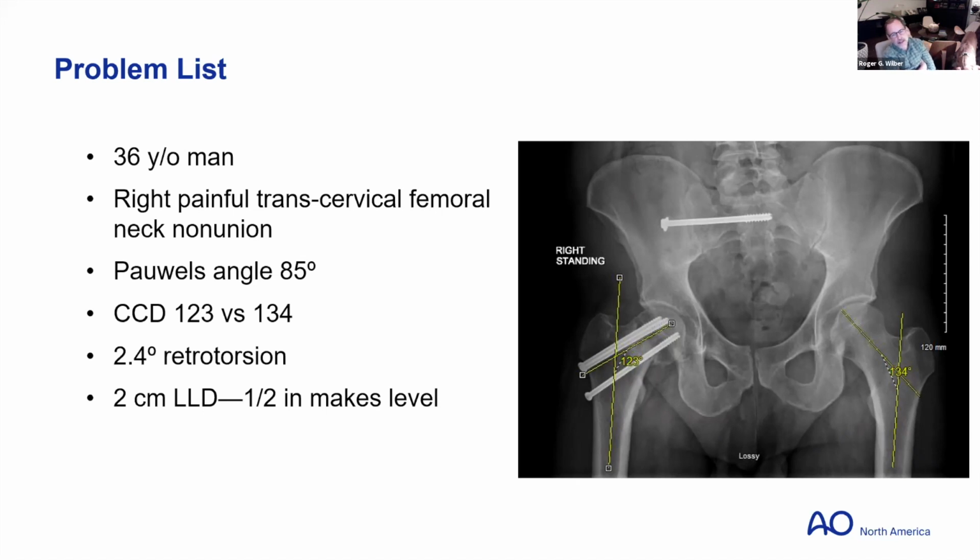My goal here would be to try to get the tip of the trochanter in the relative right position compared to the center of the femoral head. So where the tip of the trochanter is either at the point of the center of the femoral head, or I would probably try to go a little bit lower. The other side looks like it's a little bit higher, right? Tip of the trochanter is a little bit higher than the center of the femoral head. I would probably shoot center of femoral head to the tip of trochanter, or maybe just a little bit lower, a slight overcorrection because this is going to be a little short. And I think you could benefit from that.